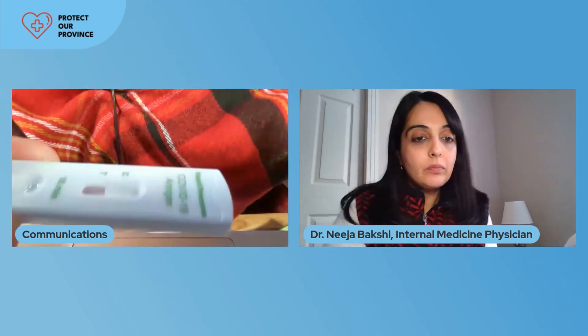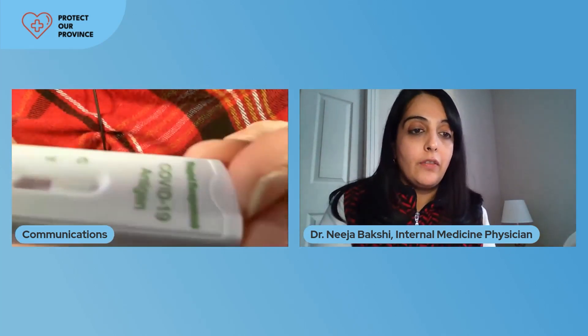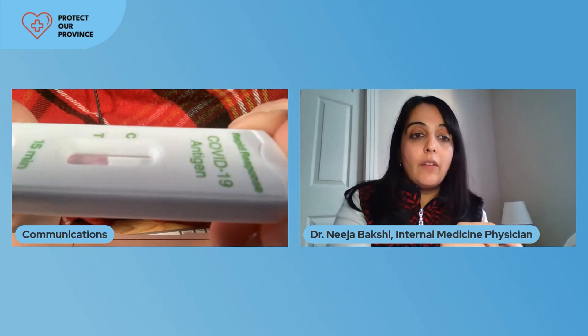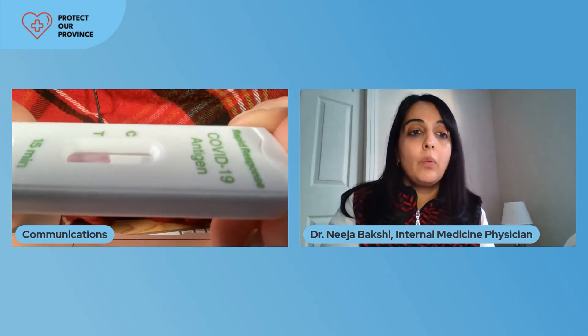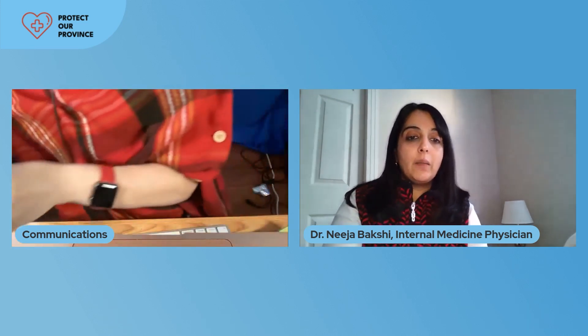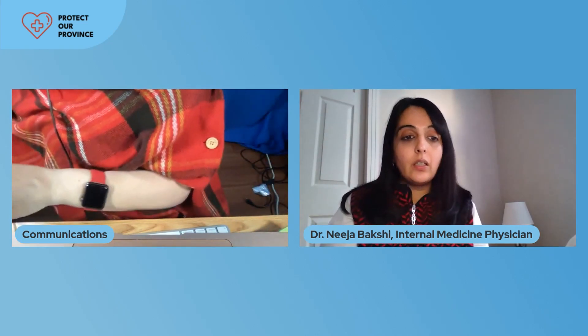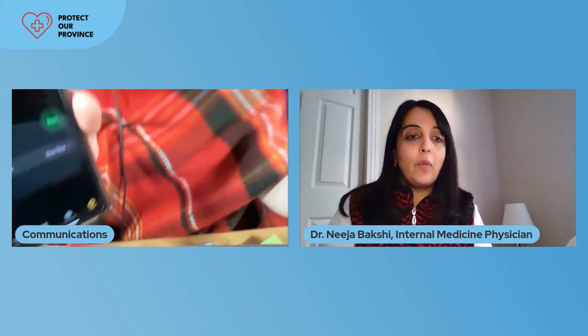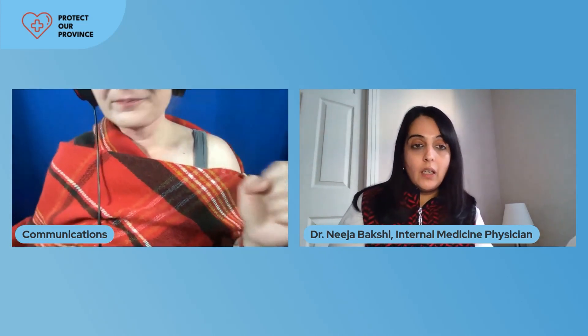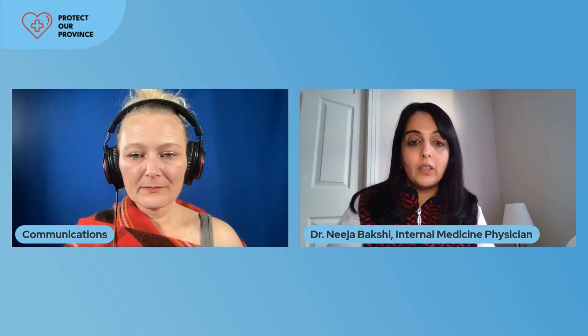As long as you see the control line, you will be able to know that the test is effective. You can see that the fluid is moving through the test — that is okay. It's okay for it to show pink throughout; the pink will clear up and you'll be left with just the control line. Set your timer for 15 minutes at this point and walk away. Once the 15 minutes is up, come back and check your test. Even if the faintest line is there by the T, that would be considered a positive rapid test, and instructions would be to call 811 or go on AHS to book your PCR test.